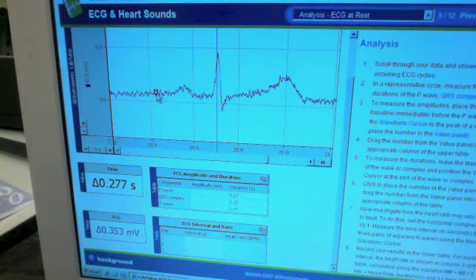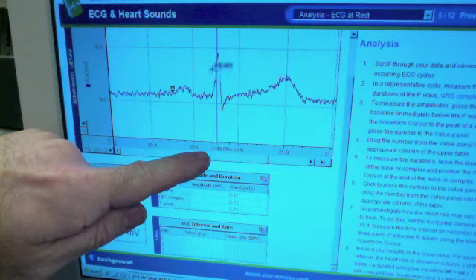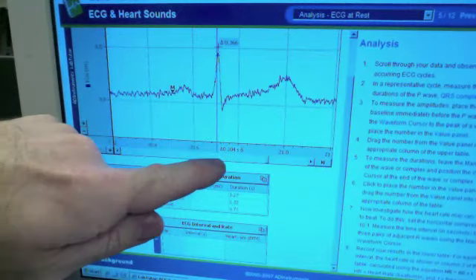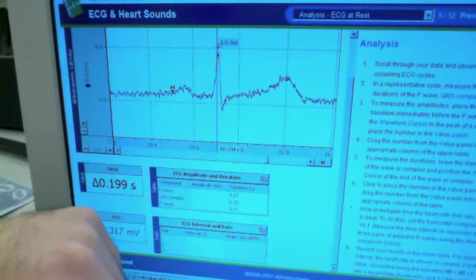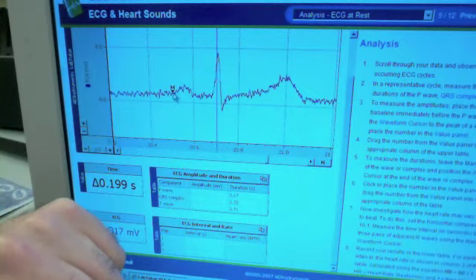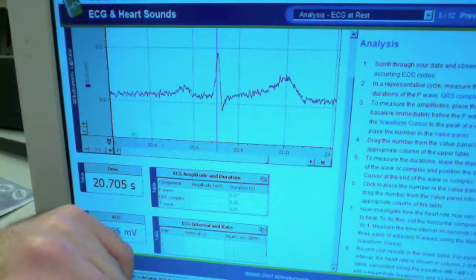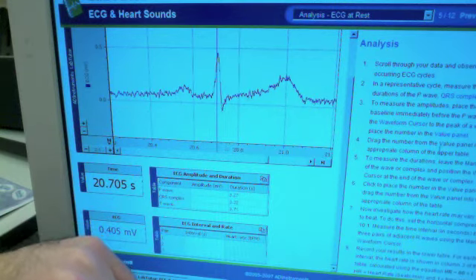So this marker here, I've set it to help me get the baseline for amplitude. I can also move it and put it right here at the beginning of, for example, the P wave, and then I can ask, well, how far apart is the P wave from the top of the QRS wave? So I have this essentially set to 0, and you'll see down here it will tell me that this guy here is not only 0.366 millivolts higher than this point, but it occurs 0.2 seconds after this time point. So I can set this any place and measure relative to that point. When I get done with it, I just put it back in this little home here. So I think that should get you fairly far.